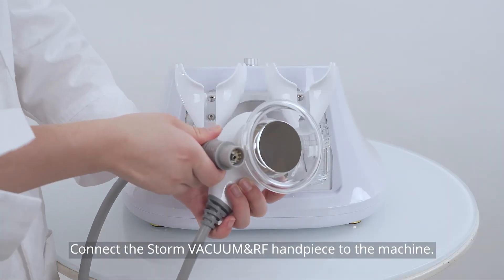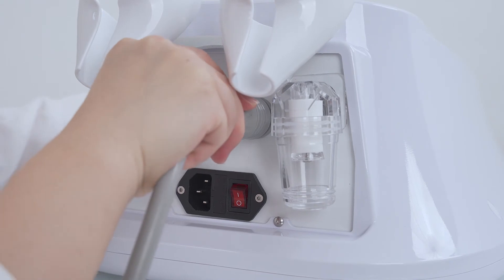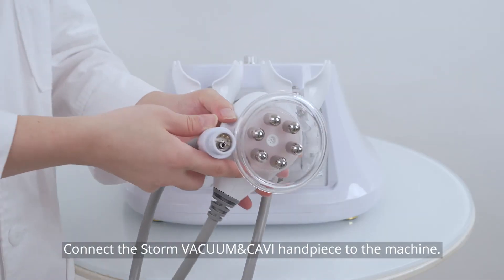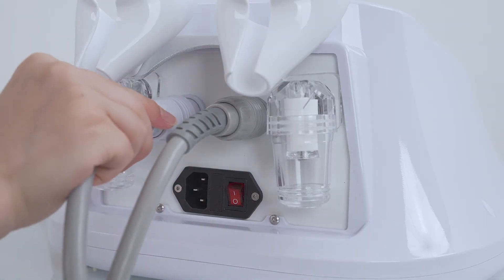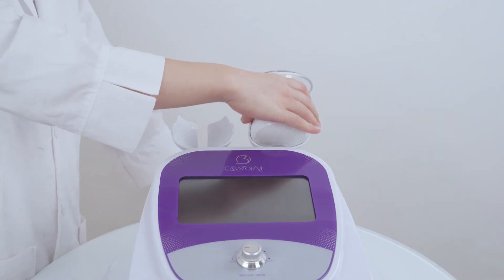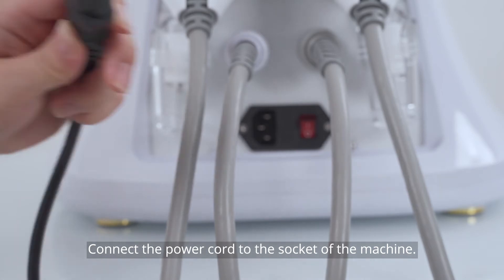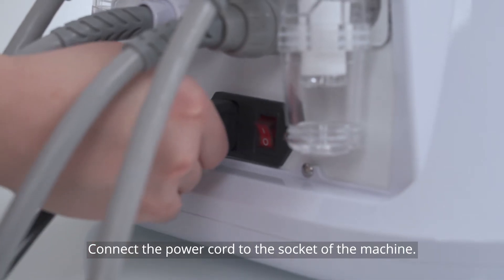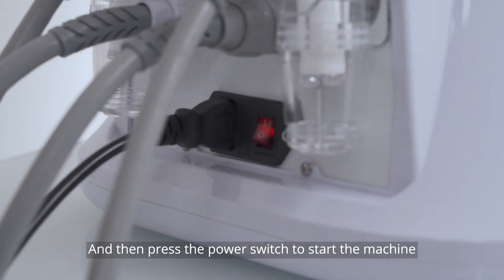Connect the Storm vacuum and CAV handpiece to the machine. Connect the Storm vacuum and RF handpiece to the machine. Connect the power cord to the socket of the machine, and then press the power switch to start the machine.